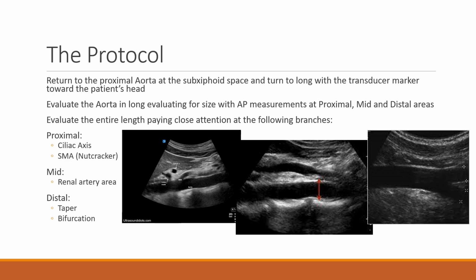So if you're ever wondering if your hand has wandered off the aorta into the IVC, utilizing color can quickly show either pulsatility within the aorta, phasicity within the IVC that would help you get back on track.